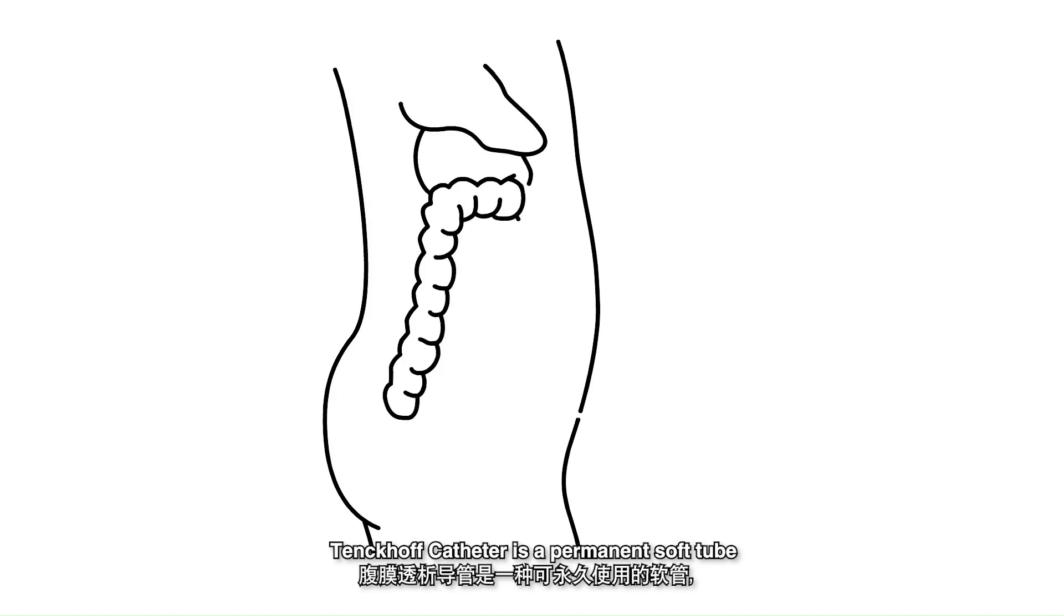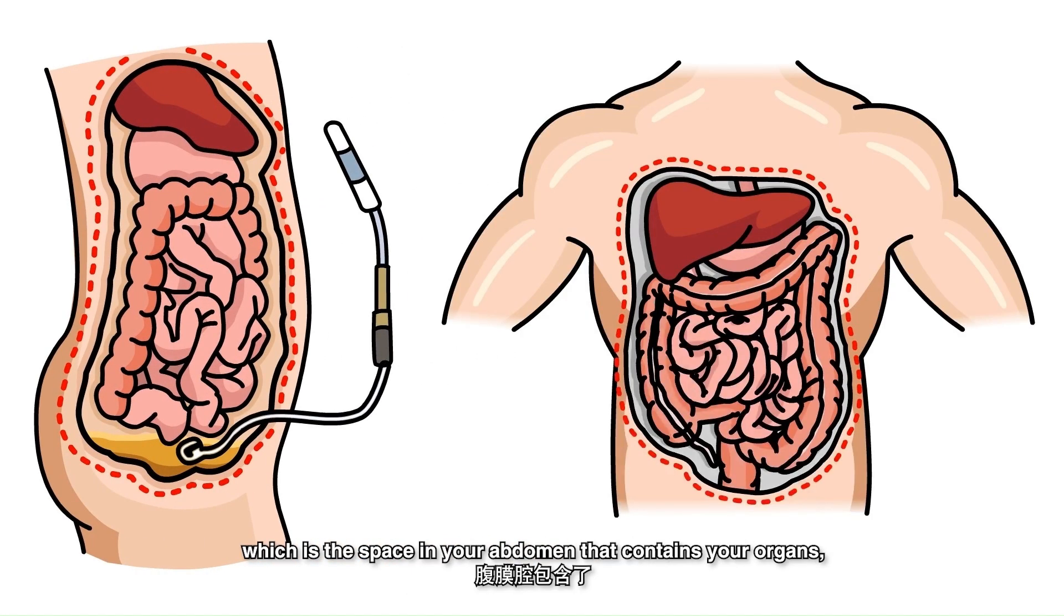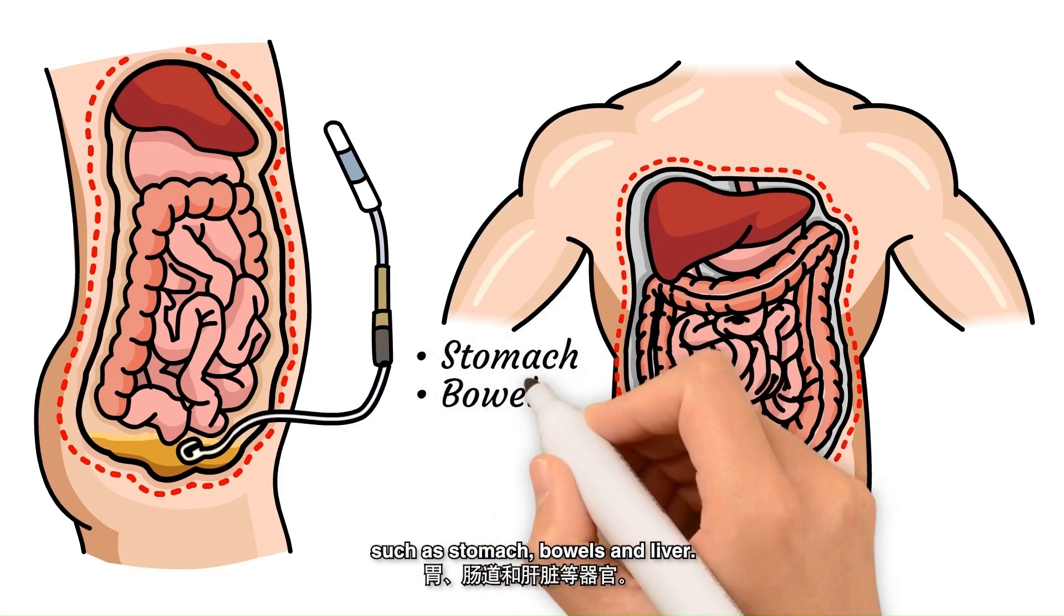Tenckhoff catheter is a permanent soft tube that is surgically placed in your peritoneal cavity, which is the space in your abdomen that contains your organs, such as stomach, bowels and liver.